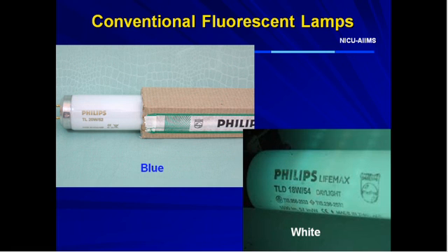Fluorescent tubes are the most common light source used. Several phototherapy devices use this light source. These tubes have the advantage of being inexpensive, but their irradiance reduces with time. The most commonly used light source is a special blue tube such as F20T12BB or TL52 20 watt Philips, which provide more irradiance in the blue spectrum than other tubes. Cool white light has also been used together with special blue tubes, as pure blue light is poorly tolerated by the caregiver and it can mask cyanosis in a sick infant.